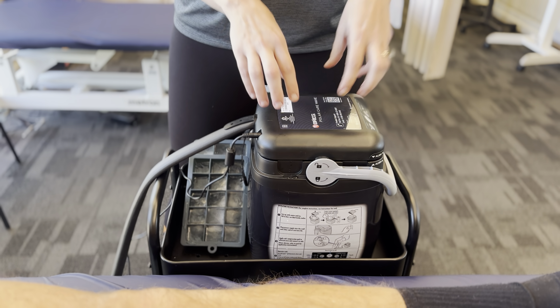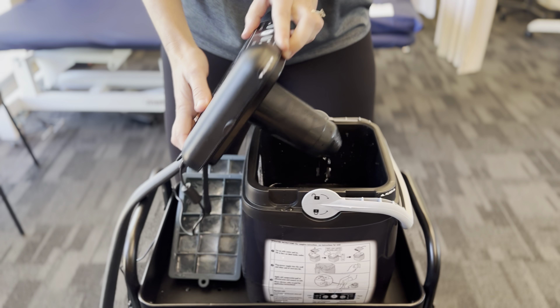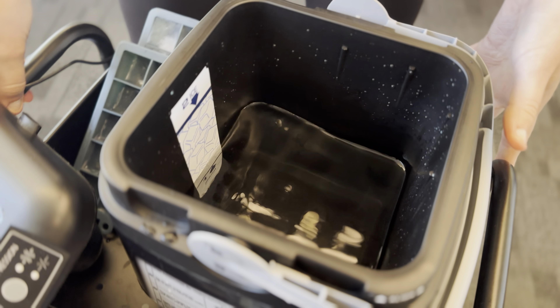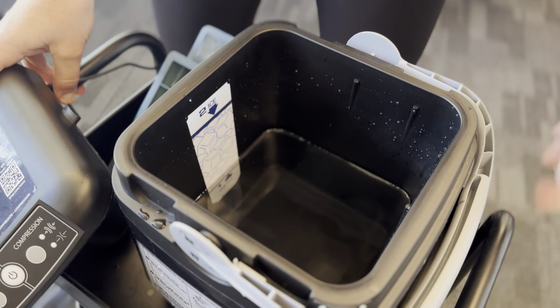When you get the device at home, it's going to have no water in it, no ice in it. So if you carefully take the top off — I've already pre-filled some water in here — there are some lines so you cannot get it wrong. You can see the line: you fill up with water to the bottom line and ice cubes to the top.